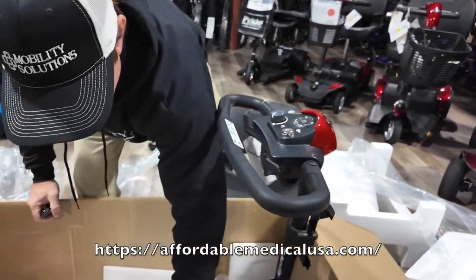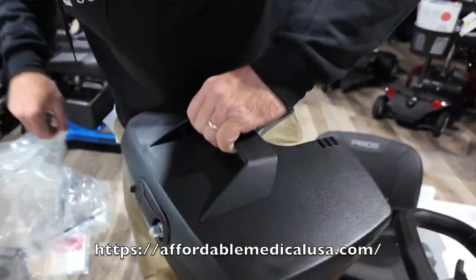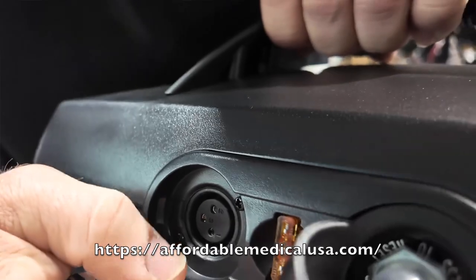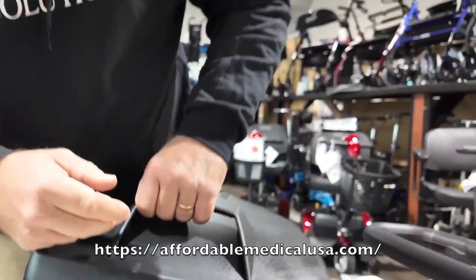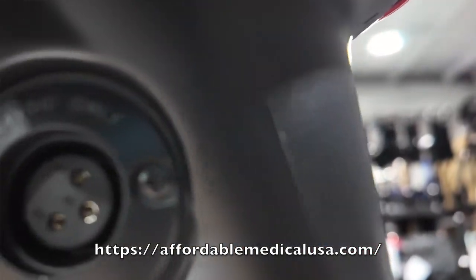Here's your battery — it's about 18 to 20 pounds. You can charge this through the battery pack, so you can take the battery into the house and leave the scooter in your car. You also have a charging port right here if you want to charge it directly through the scooter.